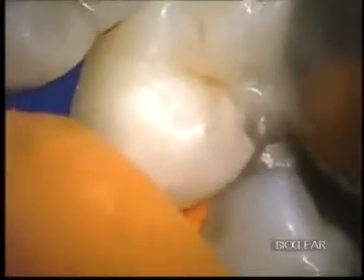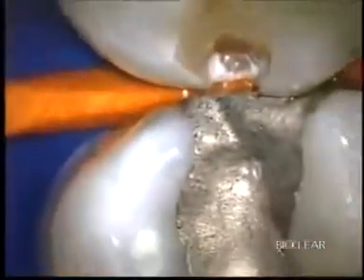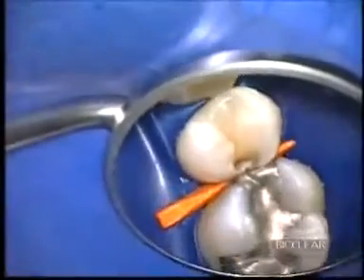Instead of cutting the boxy-shaped preparation that we used to cut for amalgam, I will be cutting a saucer shape that looks a lot like the preparation style that is common for anterior composites. One of the goals of the new Class II is to treat it more like a porcelain veneer, where we really clean the surface of the tooth and create large areas of enamel to bond to.